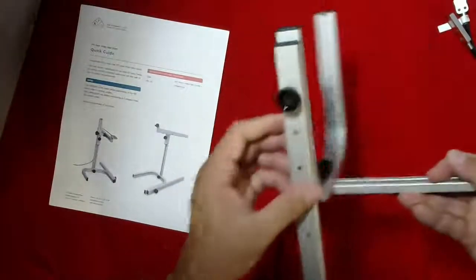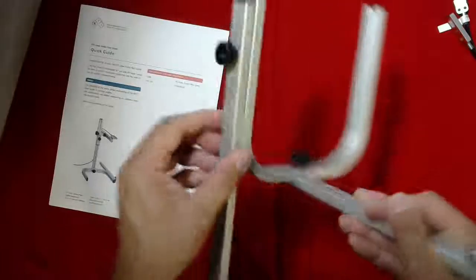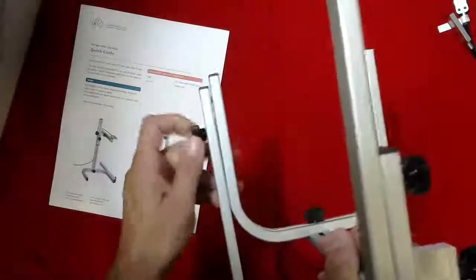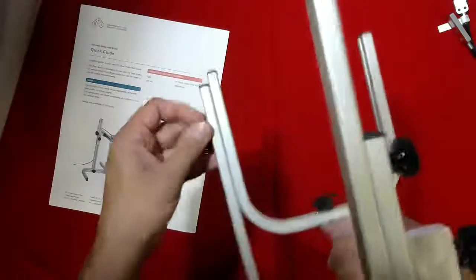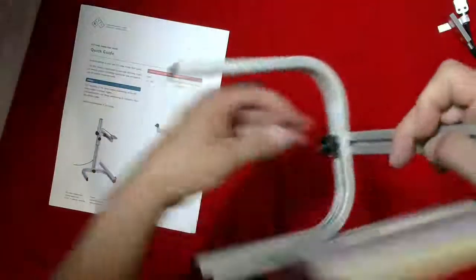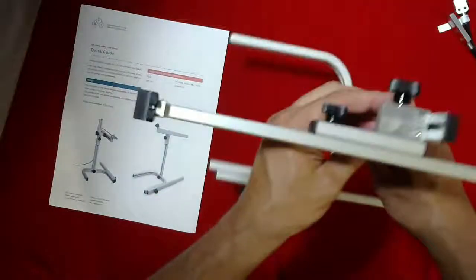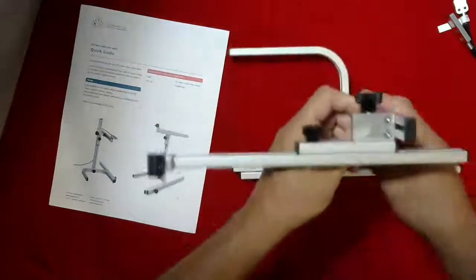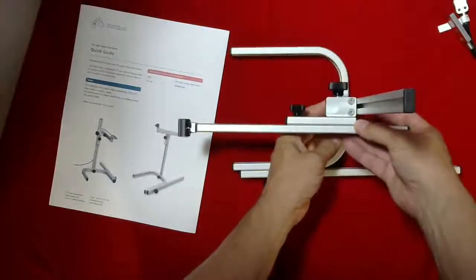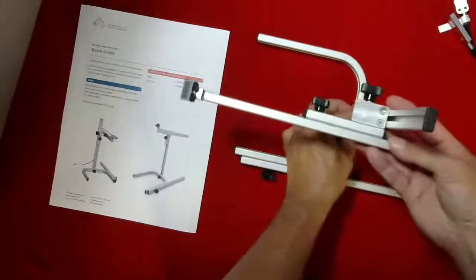There are adjustments to it. You have a thumb screw here that allows you to adjust the position and move this bar. This particular one is set at the base. This one here adjusts the arm up and down so you can slide it.